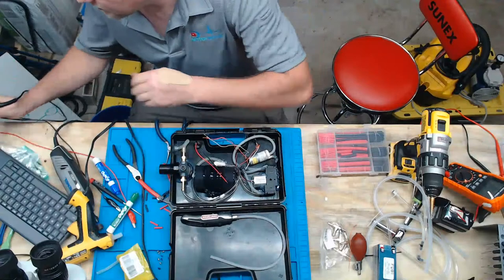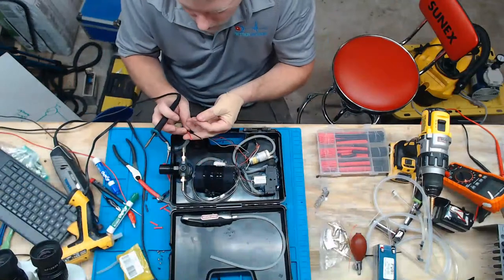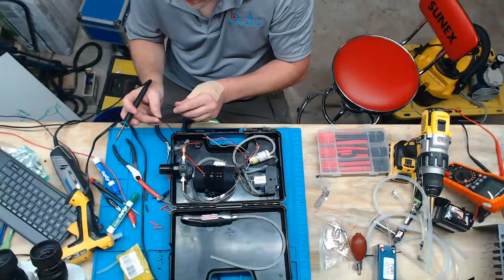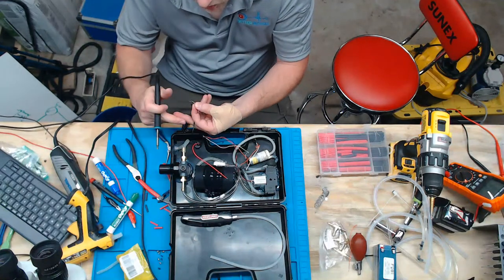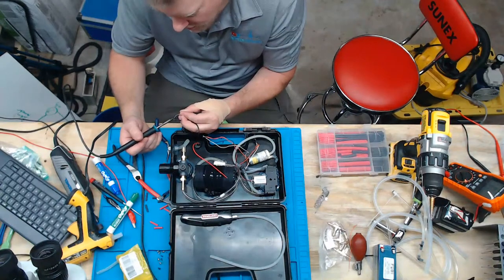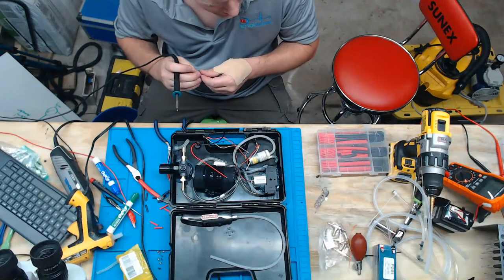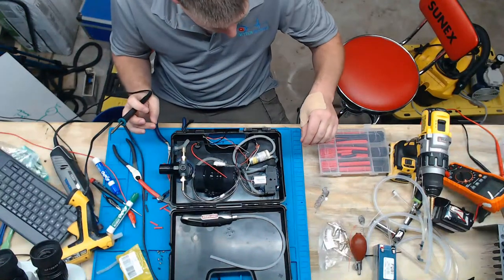Let's see, what do we got? I don't think you guys can really see it, but when I pull my soldering iron away from the tinned lead, I leave a ball of solder on there. So when I put two wires together, they just kind of melt into each other. It's very fast. It's very effective. It's just that technique of when you put solder on the wire, you hold your soldering iron next to it, and then you slowly pull your soldering iron away, and it leaves a nice little ball on the end of your wire. That is something I think a lot of people should be practicing, tinning your leads correctly, because now I can put stuff together really, really quickly.